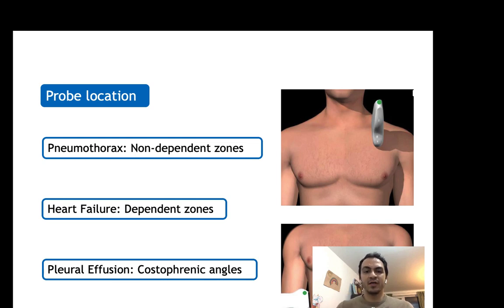When you have a pneumothorax, you will utilize the high frequency probe, the linear probe, the one we use for line insertion. And with this probe, I put it in the mid-clavicular line, second intercostal space, with the indicator of the probe directed to the patient's head. This is my initial starting position, and we will see very shortly what we expect to see.